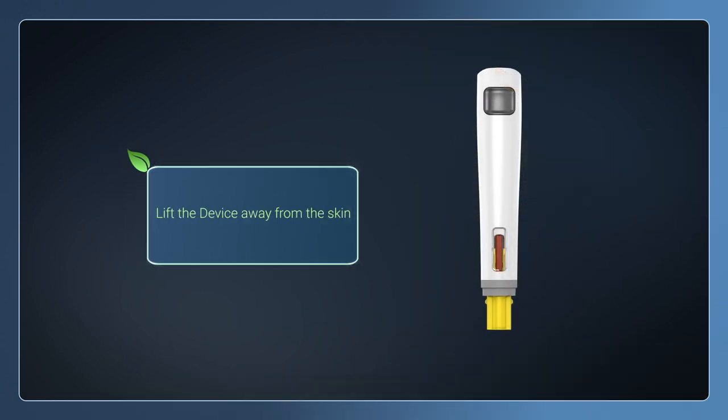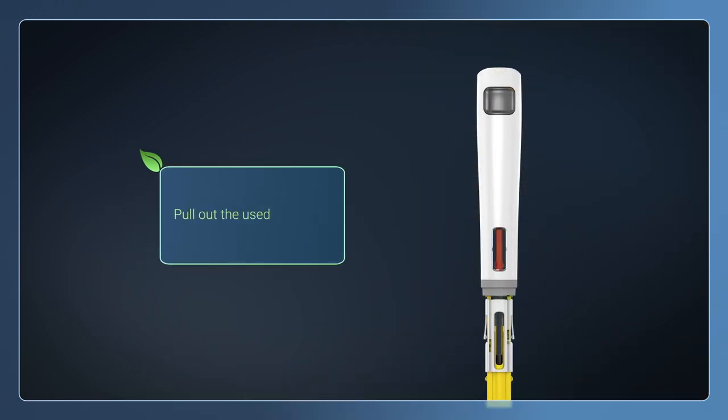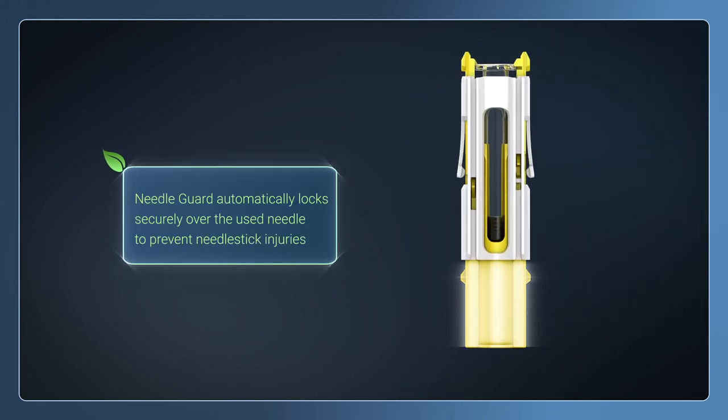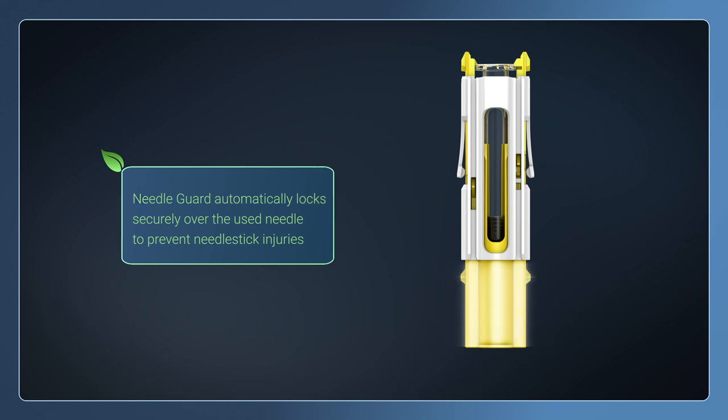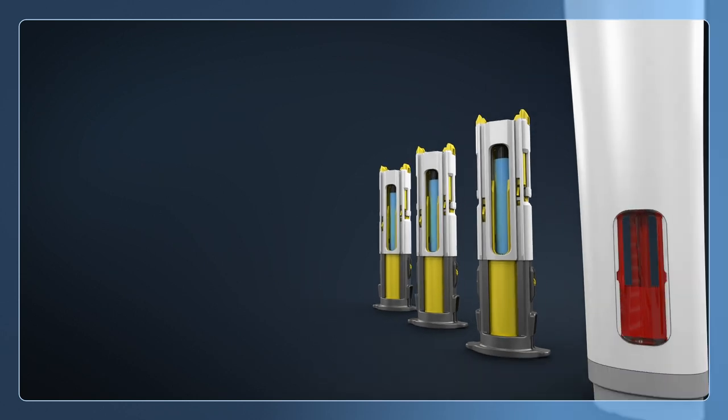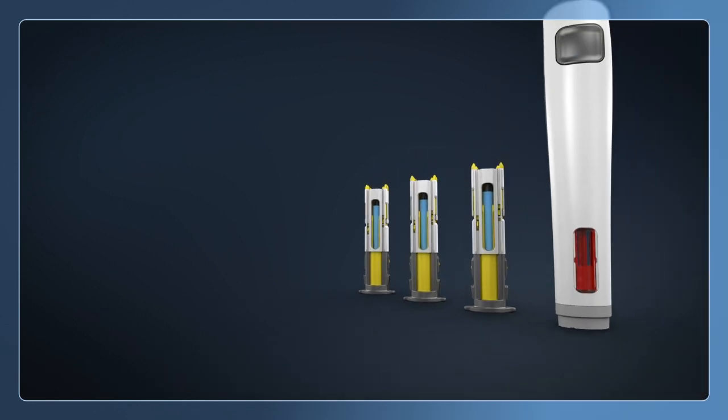Lift the device away from the skin. Pull out the used cassette. The needle guard automatically locks securely over the used needle to prevent needle stick injuries. The used cassette can now be disposed of in an appropriate container. The device is then ready to be used again for future injections.